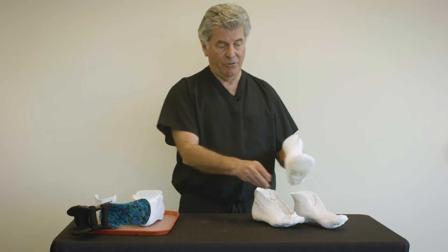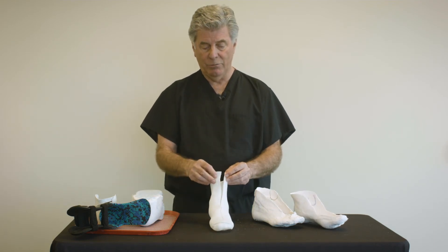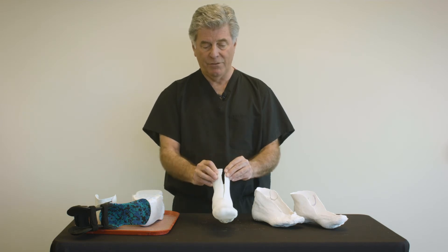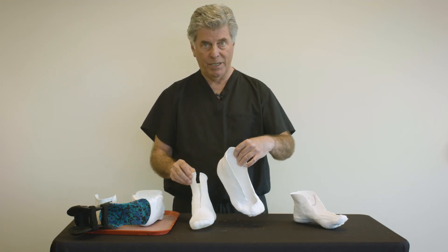A better option is the STS sock because it has little room for error when we take the cast off the patient's foot, which might over-expand when using plaster of Paris.